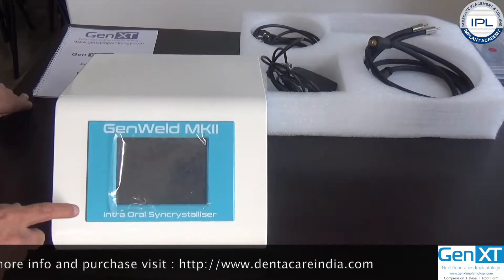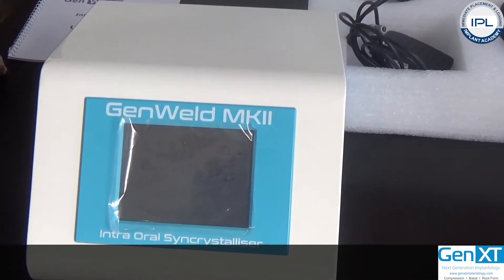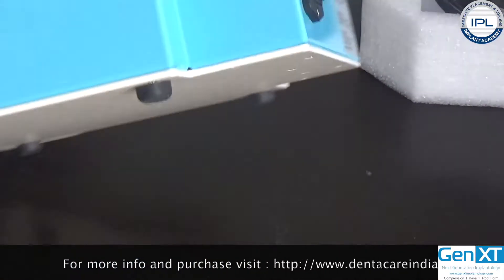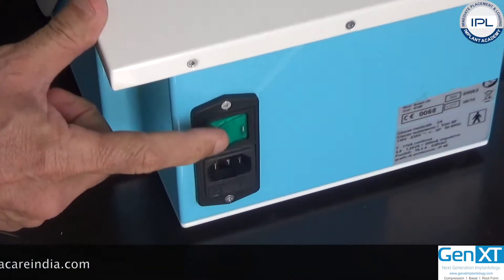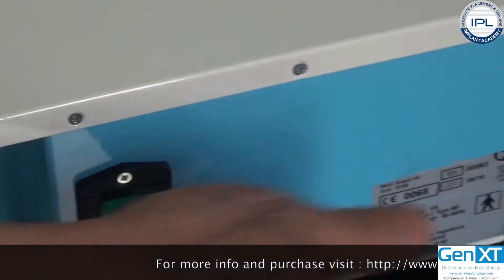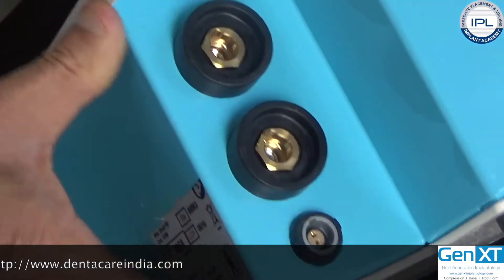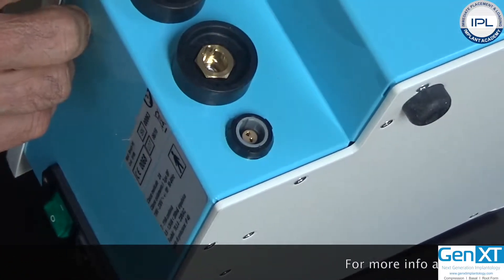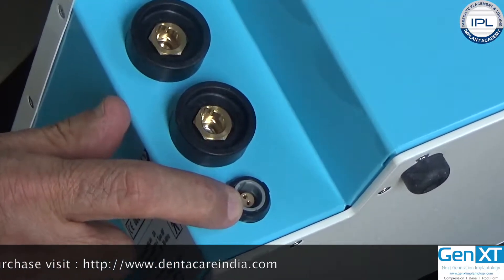On the front side of the General Mark II is the display screen — it is totally a touch screen. On the back of the machine, there is a lighted switch and the socket for the power cord. On the side of the machine, there are two sockets to connect the cable of the handgrip, and below is the socket for the foot switch.